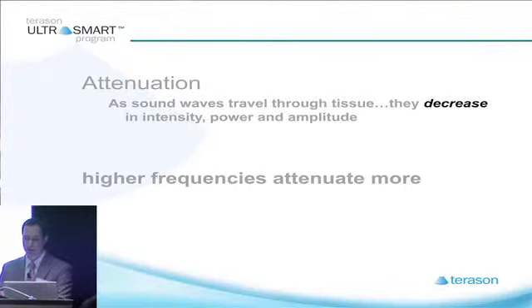Now, intensity, power, and amplitude, not really important for you to know those particular terms as they pertain to the clinical application of ultrasound, but just knowing that this is a phenomenon that's going to happen will save you headaches later when you're trying to figure out why you just can't see the thing you want to see on the screen and why it's not as crisp and clear as you want it to be. Because there may be some strategies you can use later on to help clean up some of this attenuation.